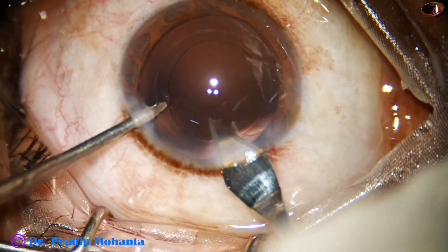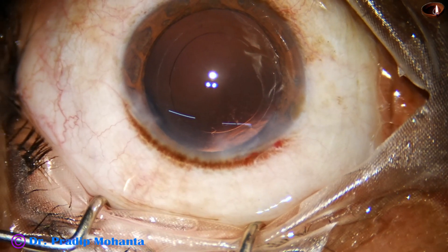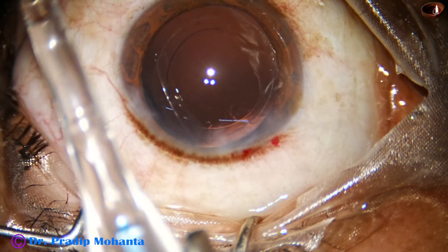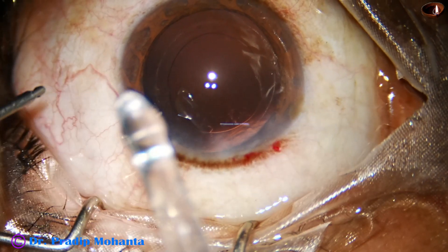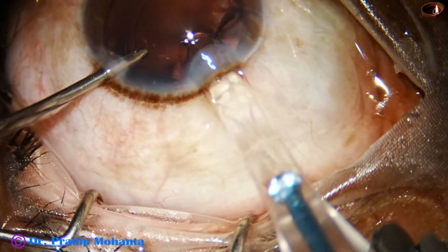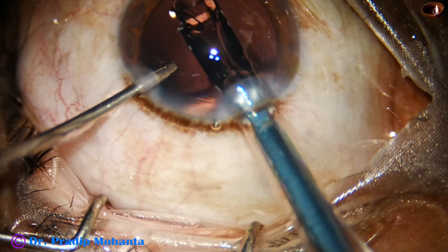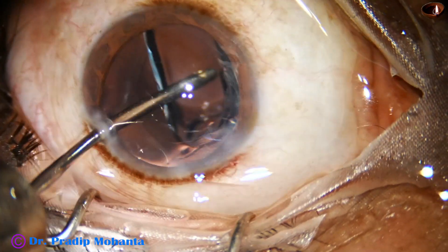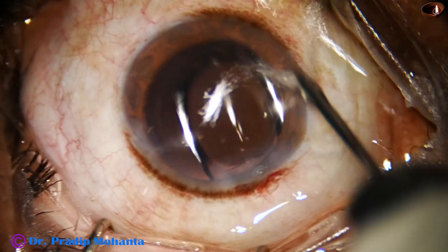The main wound is enlarged to about 3 mm. Here goes the lens. This is a hydrophobic acrylic single piece monofocal intraocular lens.